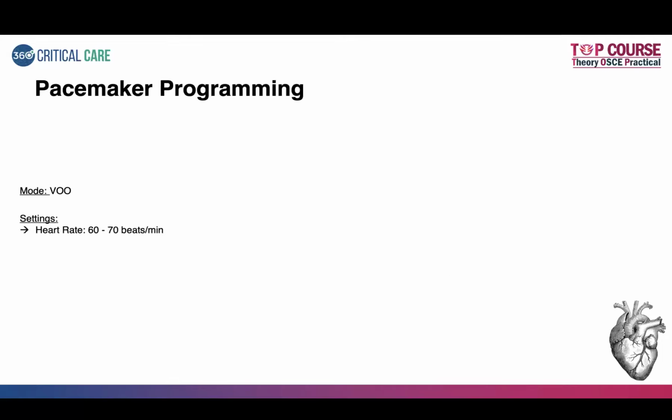So coming to pacemaker programming, this is very important. Invariably in practicals, if you get a cardiac case, they will be asking questions related to this. If your case discussion goes towards bradyarrhythmias, they will ask you about pacemaker insertion and pacemaker programming. So I would request you to concentrate on this slide.